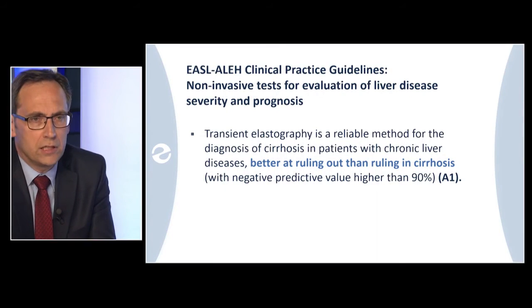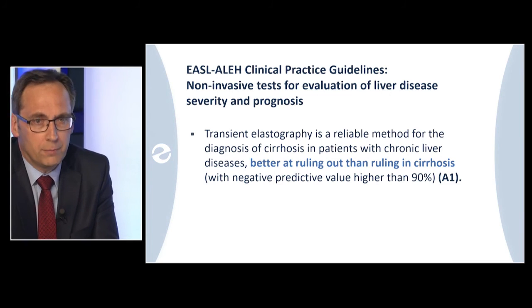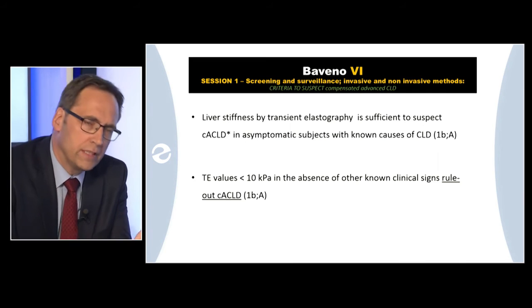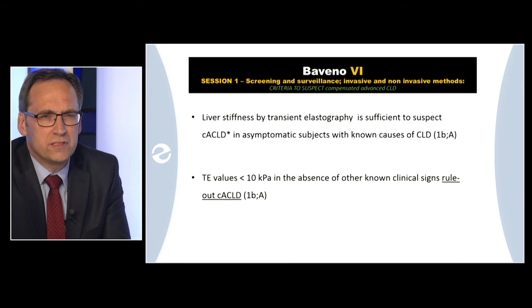I have not participated in the Baveno conference, but I know the data. As you may know, it's a full panel of very nicely configured criteria, also for the future, with homework we still have to do. With regard to non-invasive tests, including FibroScan, there are some agreements, such as the one that you see now on the slide, that of course we would fully agree with. But there are some cutoff values where I would say, yes, they're fine.